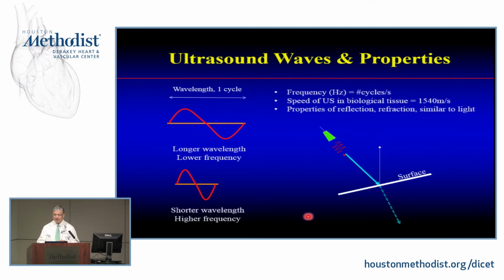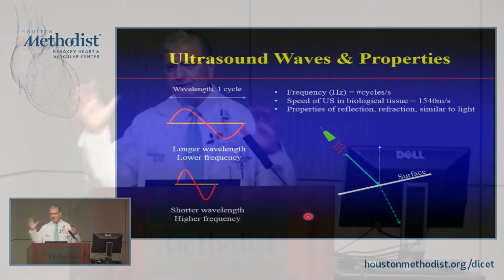Now, how do you image? It's very interesting. I grew up in Lebanon with mountains and all that stuff, right? So if I send an echo, my voice, if I talk loudly and keep talking loudly and whistling or screaming or whatever it is, you're not going to discern well the reflection of the sound off a cliff.